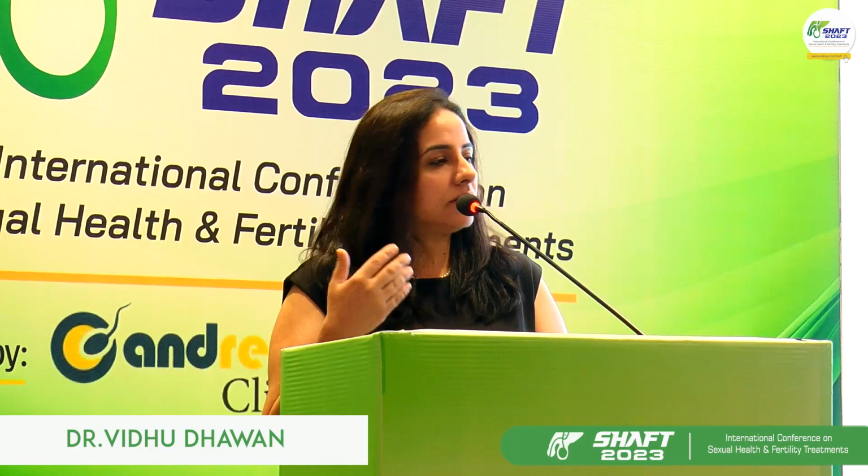I would now talk about the recent one, the oxidative reductive potential, which is your ORP. Again, it was one of the tests given by Dr. Ashok Agarwal's group. It is simple and rapid; it would just take 4 minutes. Many samples can be done, and while luminol chemiluminescence can be done only in a fresh sample, this test can be done in both fresh and preserved or stored semen samples as well. That is a bigger advantage it gives. It gives the ORP levels, but it still needs further standardization and evaluation. And this test has been included in the WHO manual as such, right?